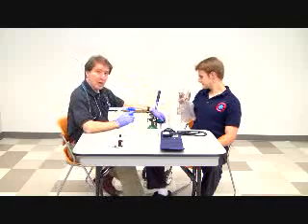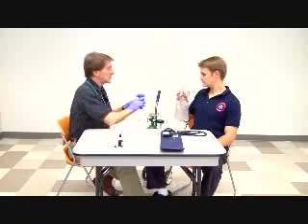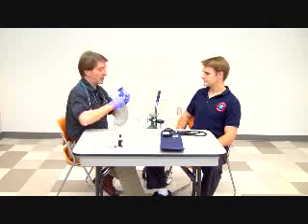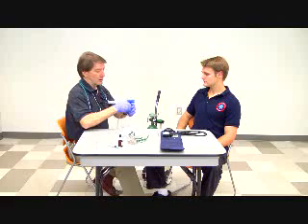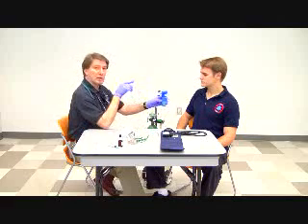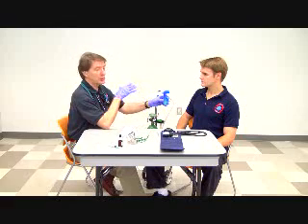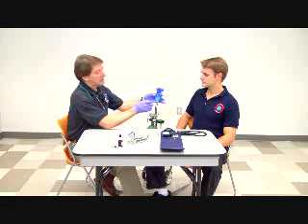Okay. I have my oxygen running at 12 liters per minute. I'm going to bump it down to 6. Take the patient off my high flow oxygen. Connect the nebulizer medication, and then the patient is going to take approximately 1/2 of the medication as I instructed, and I'm going to monitor the patient the whole time he's doing it.